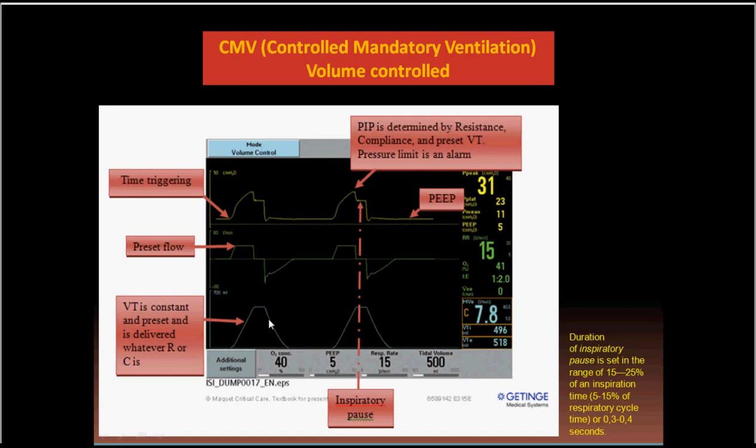The expiratory valve is opened, and then the expiration starts from here. This is expiration. And this is the expiratory time. This is the total expiratory time. This is an expiratory pause. No more flow, either in or out, and the patient is in a steady state.